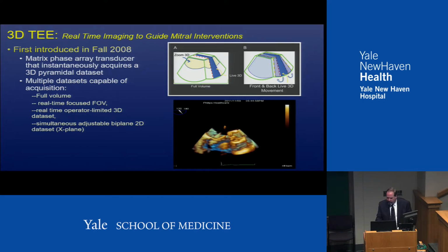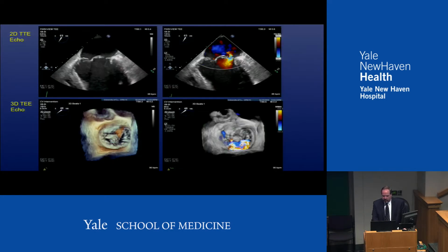This is a balloon valvuloplasty. Oh, okay, it's not wanting to play. But anyway, you can get a shorter section. You focus on a specific area, and that gives you the resolution, and I'll show you some images.